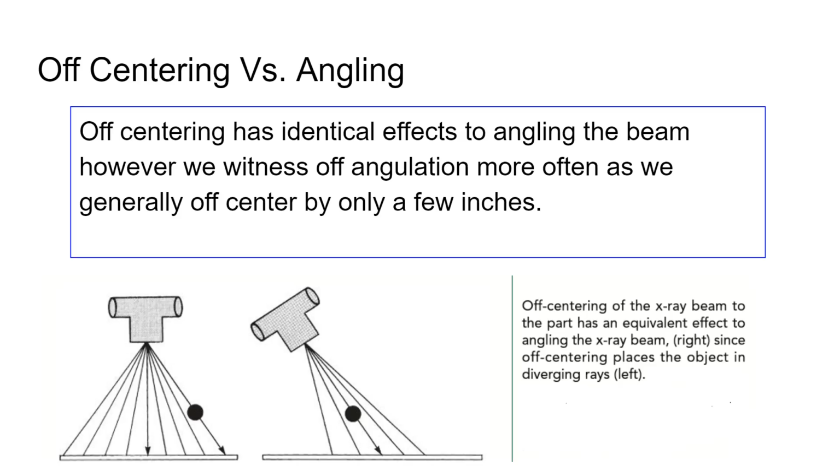When you angle the tube, generally you're putting more than 5 or 10 degrees on the tube, right? What's the lowest amount you've seen? Maybe the lateral knee? Lateral knee is what, 7 to something? 3 to 5? 3 to 5. So like knee. Yeah, just about everything else is more tube angle.